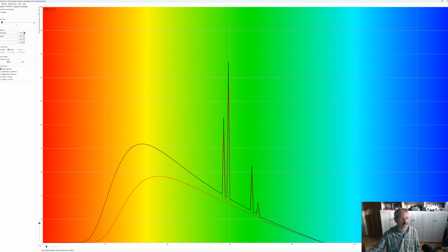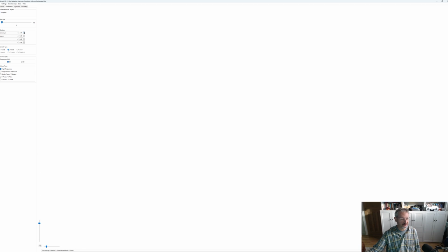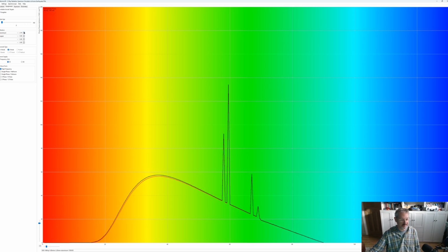And as I say, the legal requirement, I believe, is 1.5 mil of aluminium, and in the modern era most X-ray tubes have nearer 3 mil of aluminium. Our basic tube that we model is 3.2 mil of added aluminium filtration, and then you add copper, and we've already seen how that works. So that's the answer to your question. Thanks for asking it.